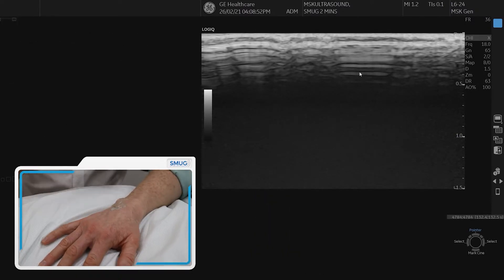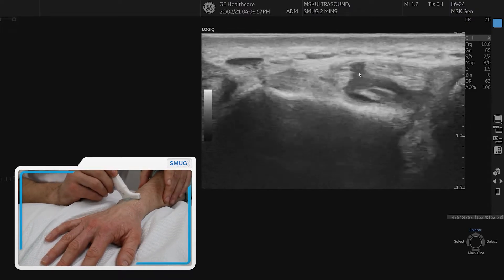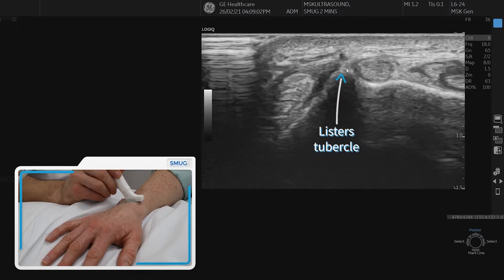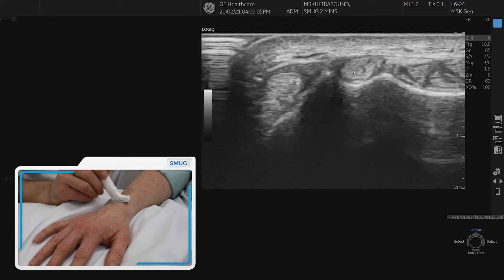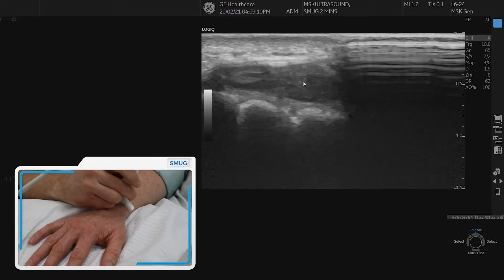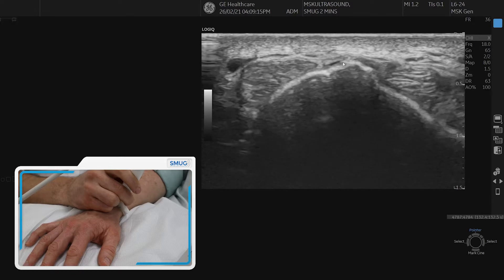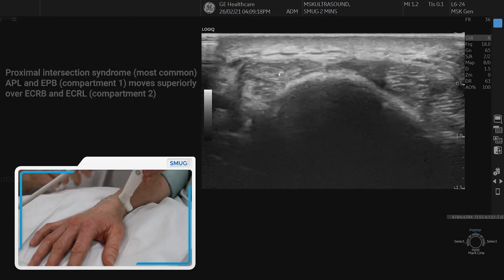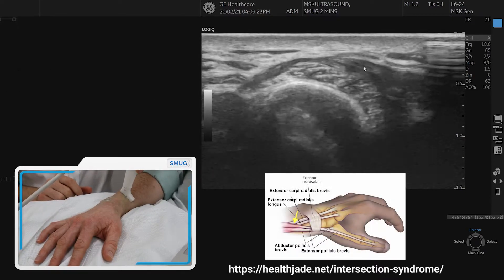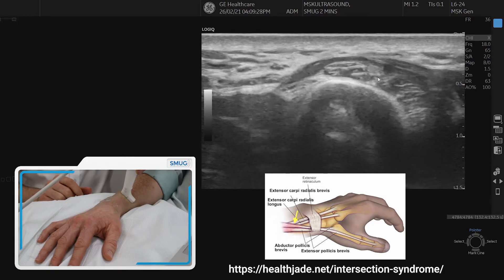At any point you can spin into longitudinal section to assess. Now let's go back to our landmark, which is Lister's tubercle. There are two intersection syndromes we need to be aware of. The first intersection syndrome is where extensor compartment one moves over the top of extensor compartment two — that's your classic intersection syndrome, sometimes called the proximal intersection syndrome.